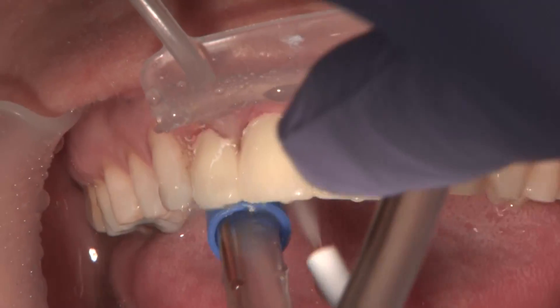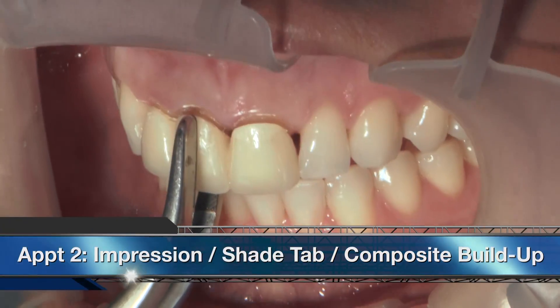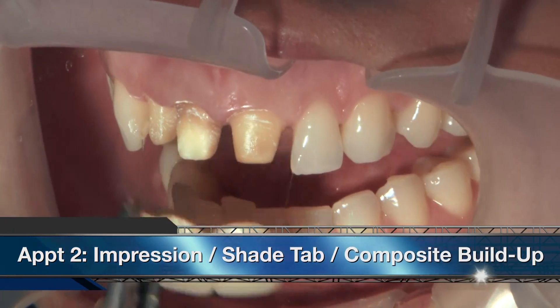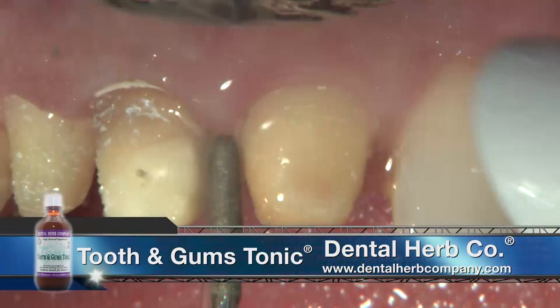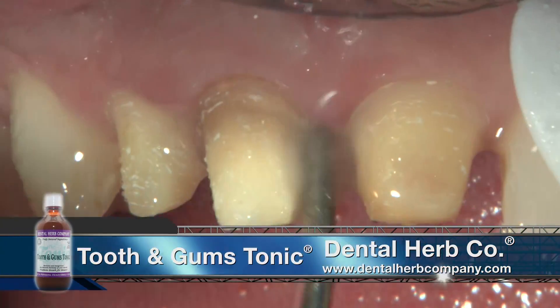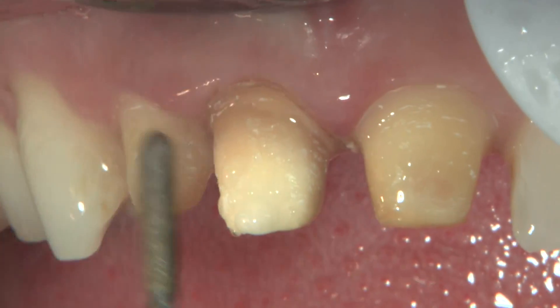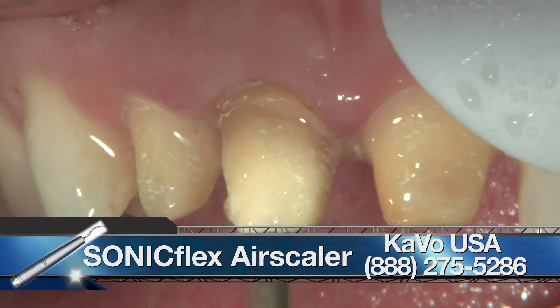We're looking to make sure we don't blunt any papilla — in fact, we want to see black triangles while the biotemps are in place so the patient can rinse with Tooth and Gums Tonic from Dental Herb Company, which is my favorite way to keep tissue healthy. Tissue is looking pretty good two weeks later, so we're going to impress today. The walking bleach looks like it's worked pretty well on tooth number eight, at least in the incisal two thirds.